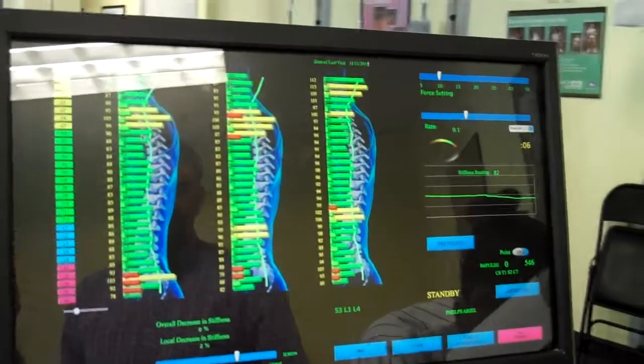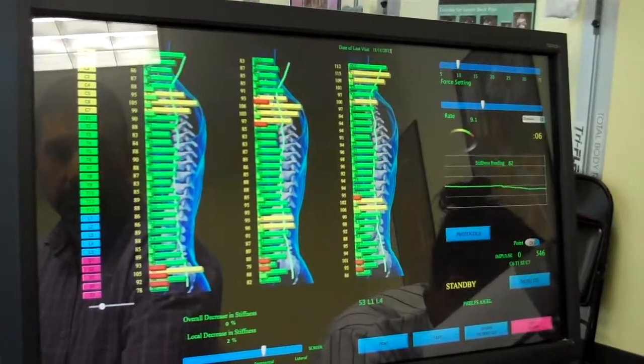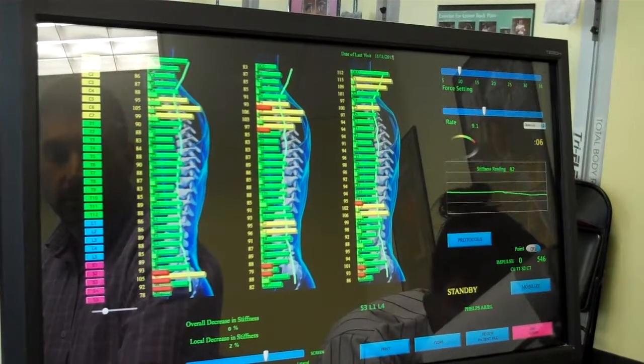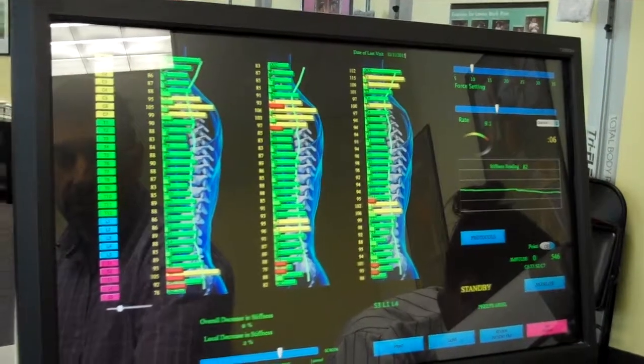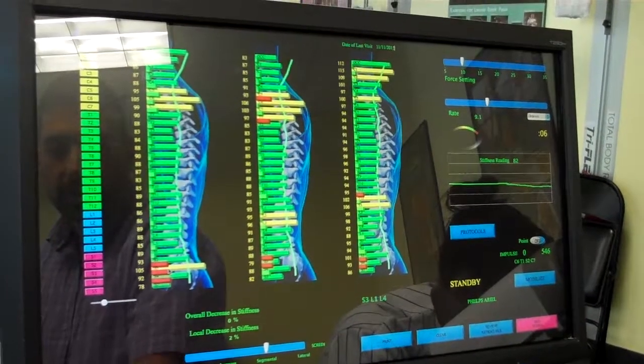So what we see here in Ariel's case is that most of the cervical component, this was the first scan today, has resolved. There's still some muscle tension in there, but you can see here the sacral area has not.